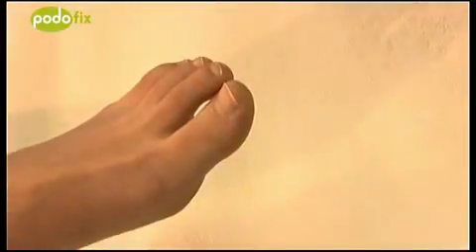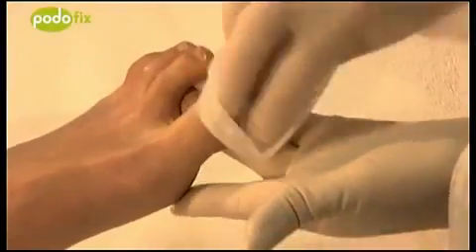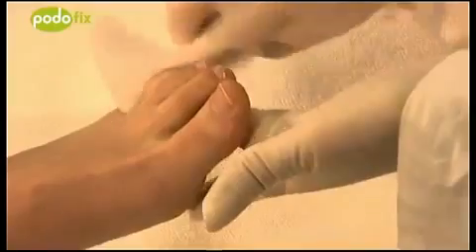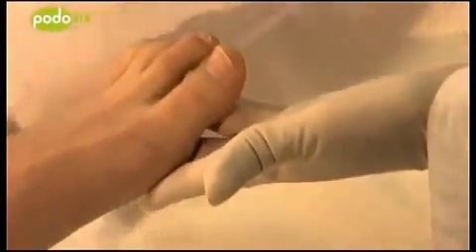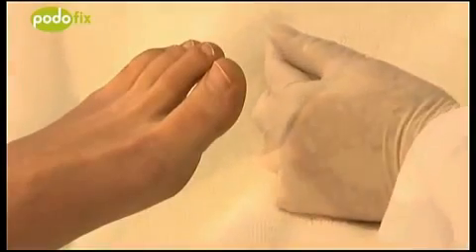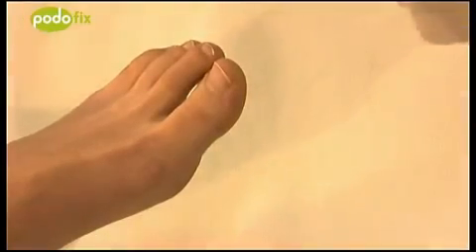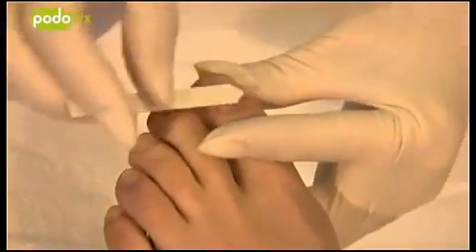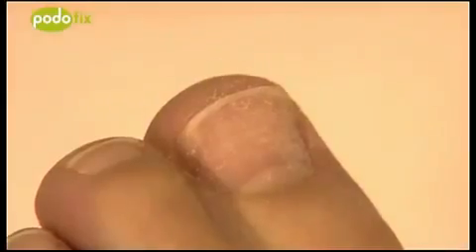The nail area is disinfected, but please note that the nail should not be softened before using the brace. Avoid foot baths and callus softeners before use. The nail must, before adhering the brace, have the smoothest and most flat surface possible. If required, a milling device or a soft nail file is used to smooth the nail surface or to grind it down a bit. Any loose parts of the nail are removed.